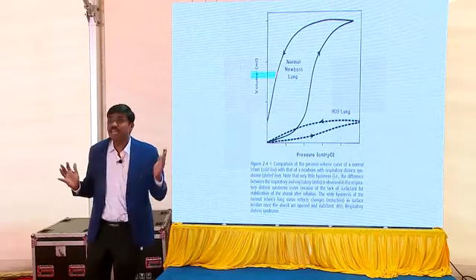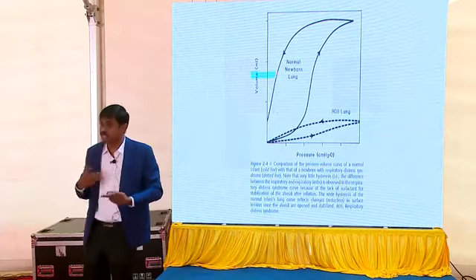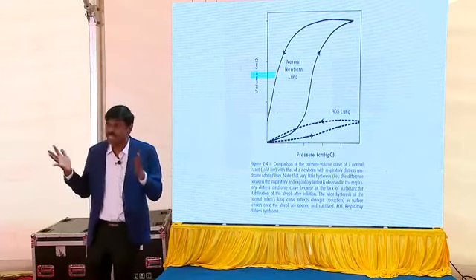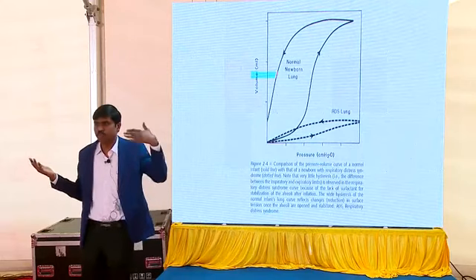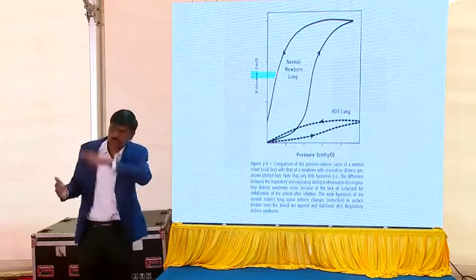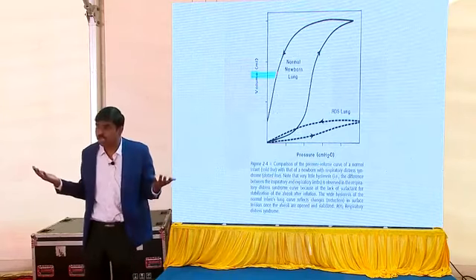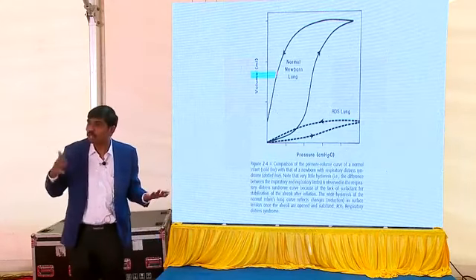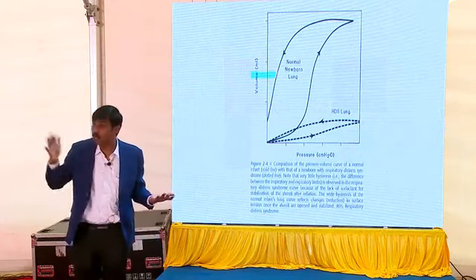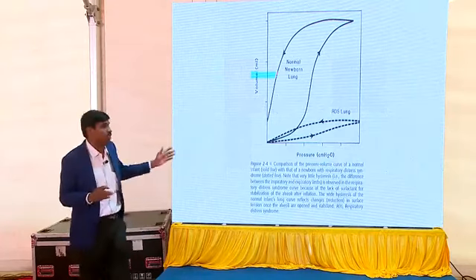Next day, you find that the curve is flattening again. What is going wrong here? Do we need to give one more dose of surfactant, or are the baby's lungs getting flooded? Imagine you got a preterm, you gave surfactant, and it is standing. Next day, you find it has started sleeping again. What all possibilities could there be? One could be a PDA, or slowly you started having some infection where your lung is again becoming stiff. So this will give you a good idea of the dynamic changes which are happening.